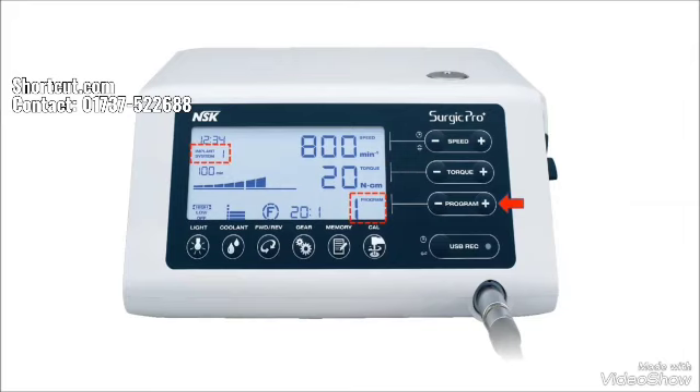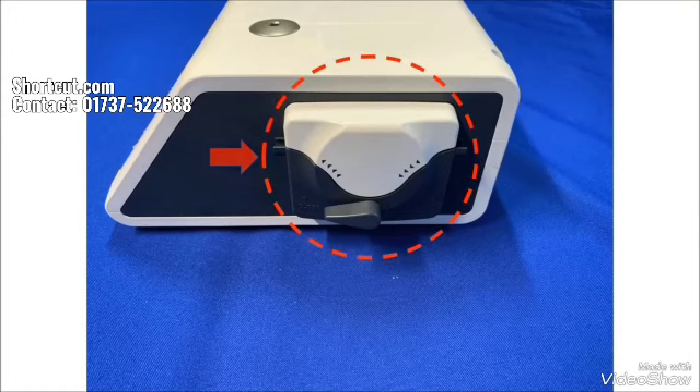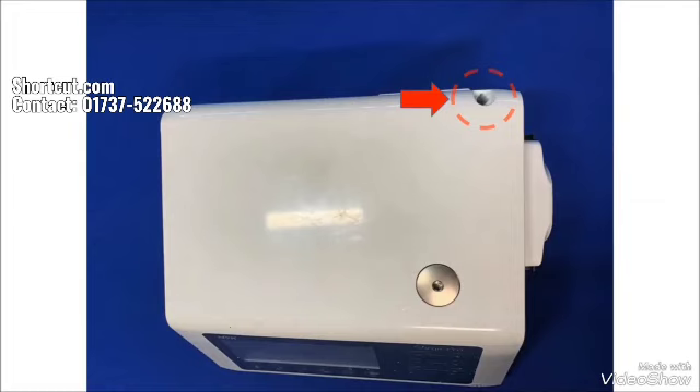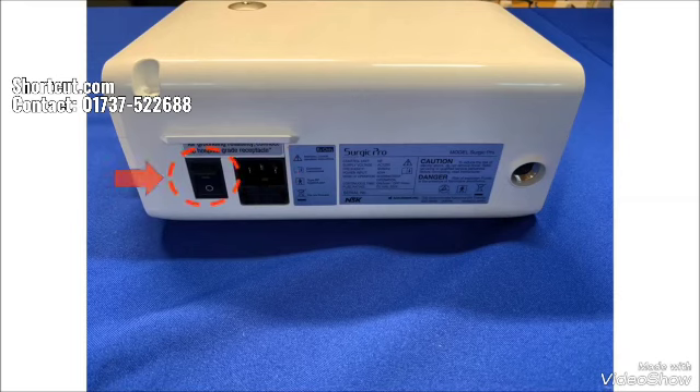Important parts. Micromotor cord jack where you attach the micromotor cord. Irrigation pump to pump the saline to the burr. Coolant solution hanger post holder. AC electrical cord connection jack. Main power switch. This is the fuse holder. And the foot control cord jack.